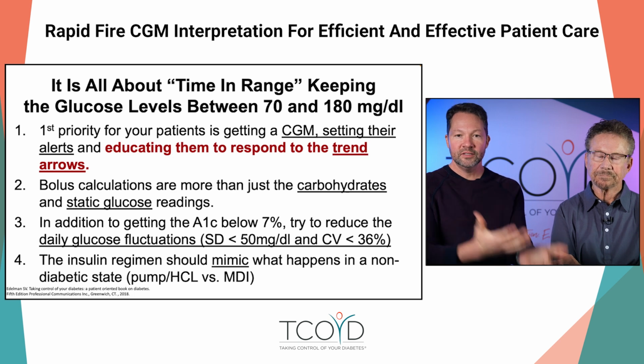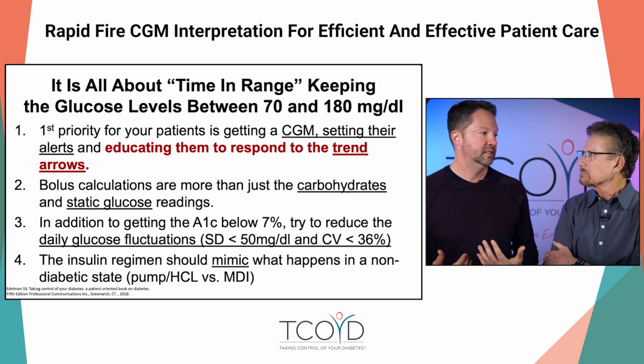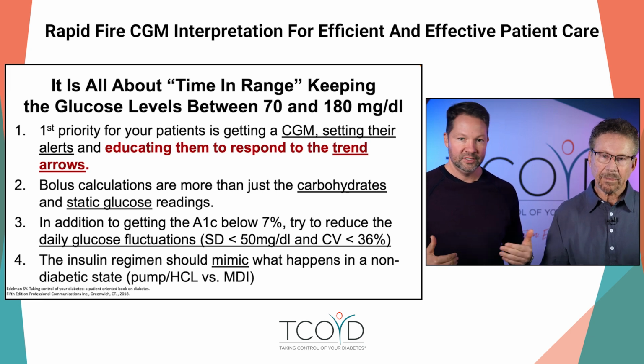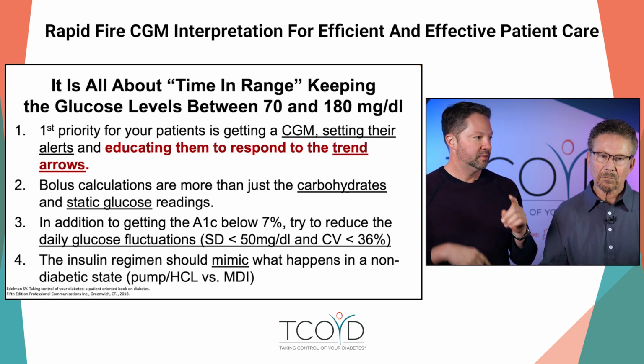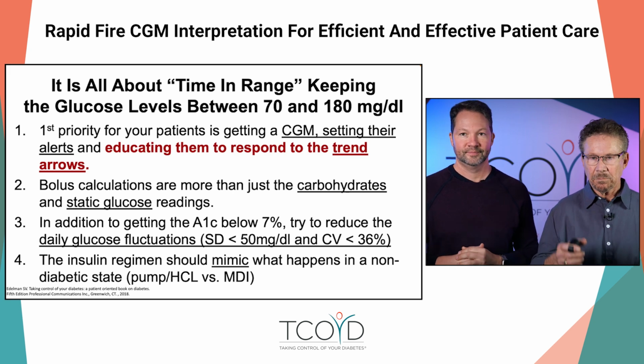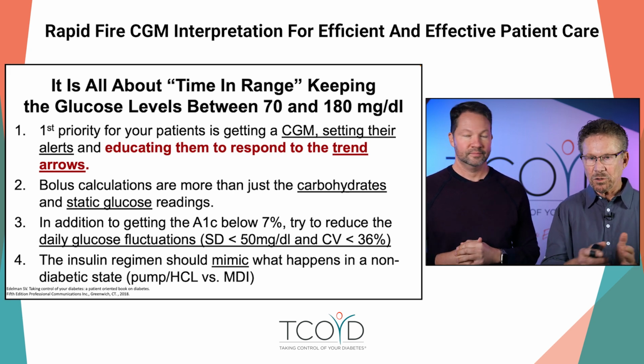And then, of course, the insulin regimen that you're using should mimic what happens in normal physiology. So if you're on shots, you obviously need basal and bolus. And then if you're on pumps, how to teach patients how to use both those features. Yeah, we used to say to people at the Taking Control of Your Diabetes conferences, multiple daily injections or a pump, the choice is yours. But now with hybrid closed loop, the HCL, it's a different ballgame. Yeah. And we're not going to talk too much about that. But it's an important issue, important advancements.